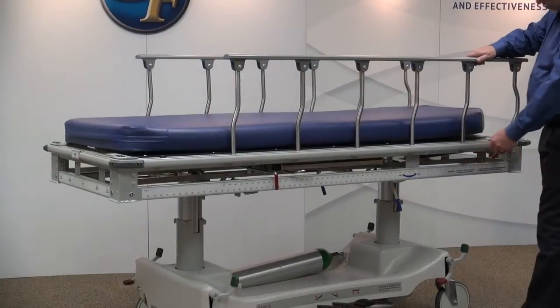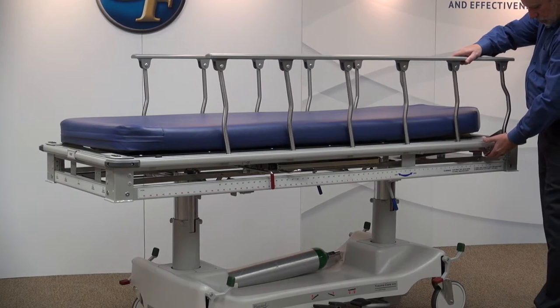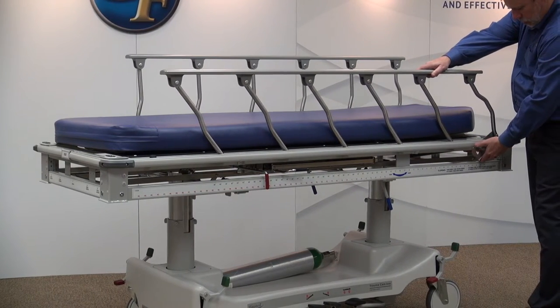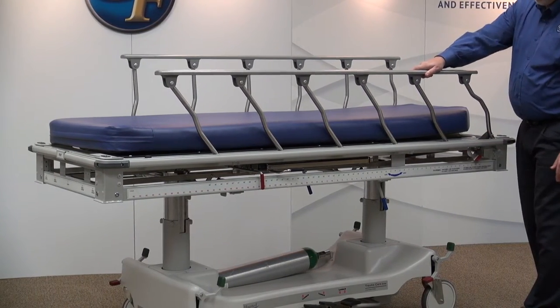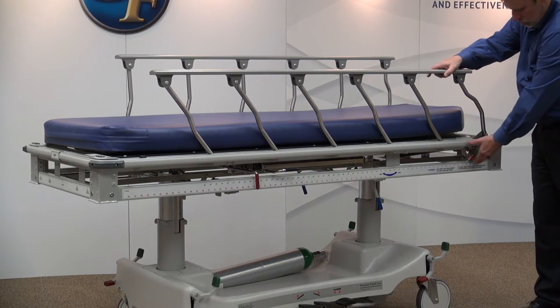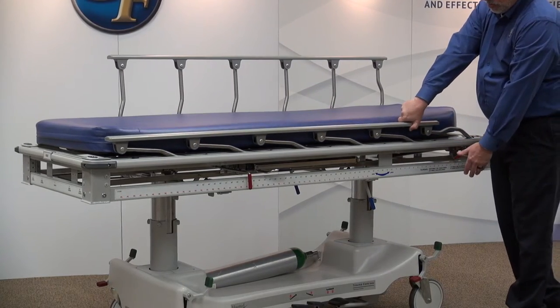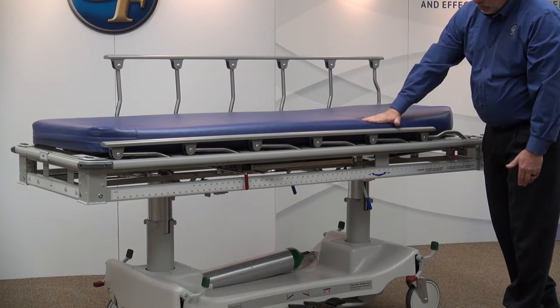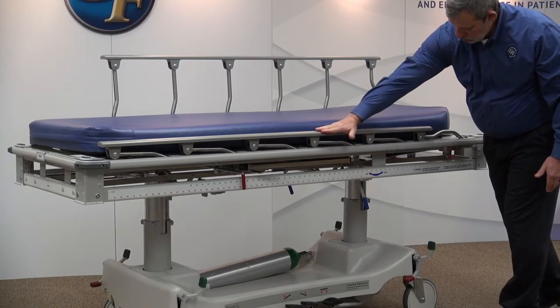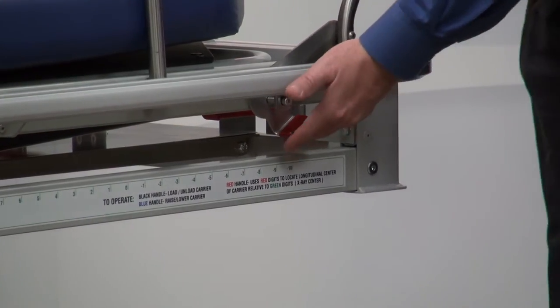The X-Ray Trauma Stretcher features the Hosted Retracto Rails. These rails have three positions including full up for maximum patient security, mid position for allowing patient access and security, and fully lowered for patient transfers. The rail cap design also eliminates any gaps during patient transfers. The positioning of the rails can be adjusted by pressing on the red rail release lever.